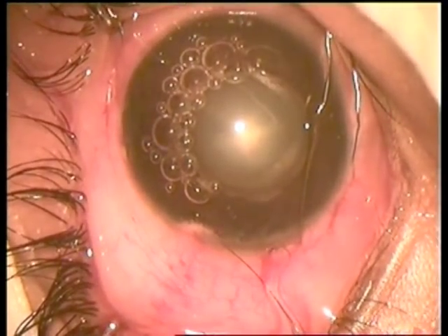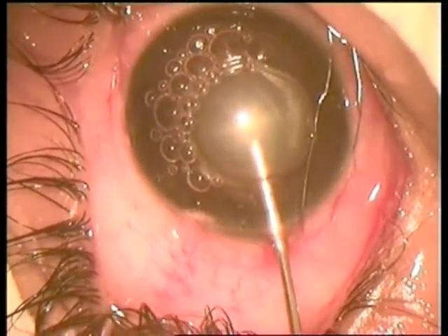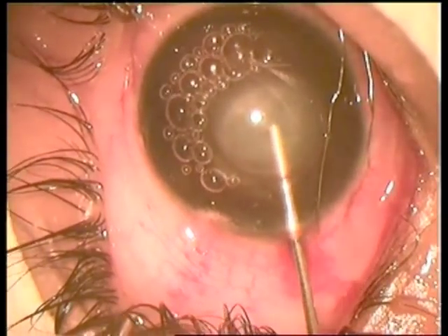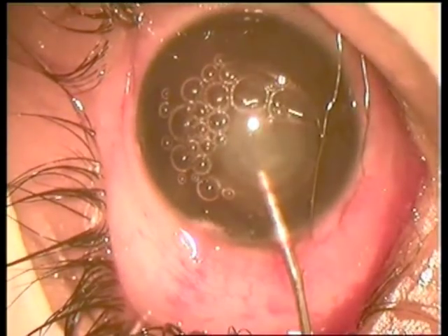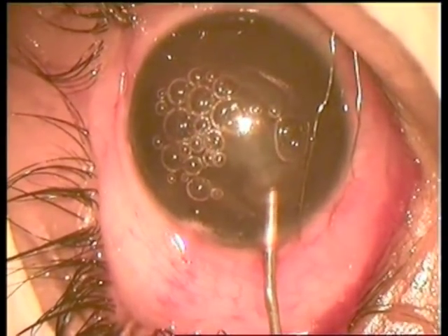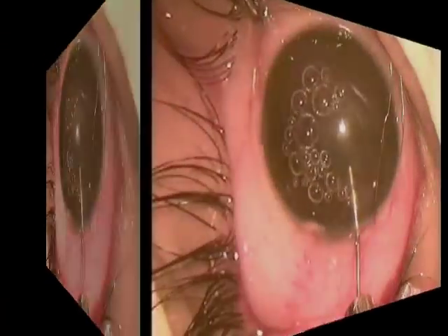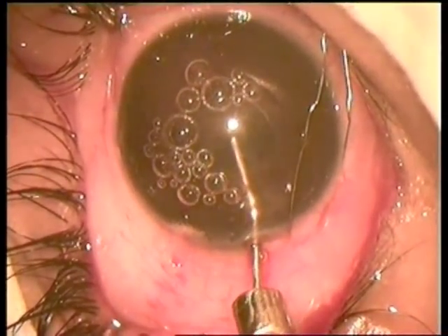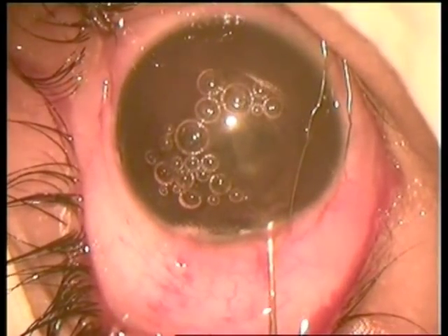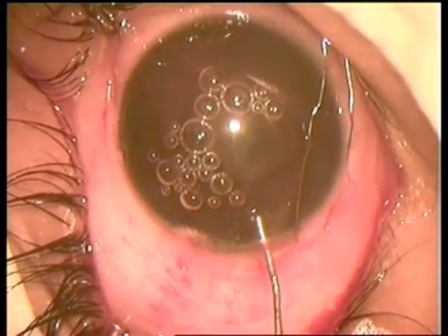The child is only two years of age. The lens matter is aspirated with a 22-gauge cannula. All of the lens matter is removed. Irrigation of the bag is then performed.